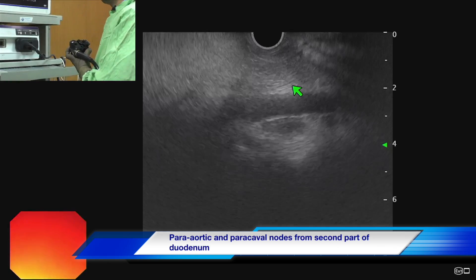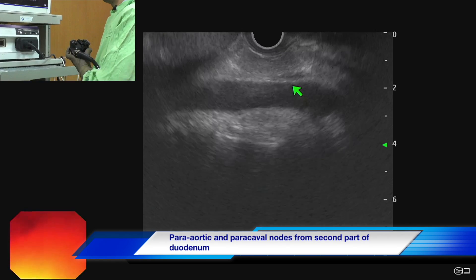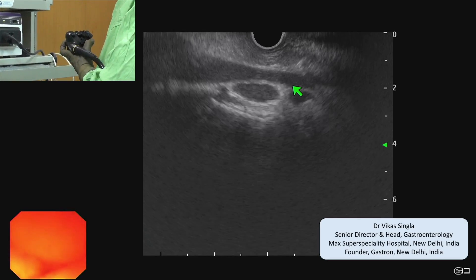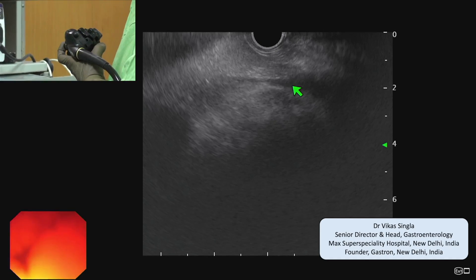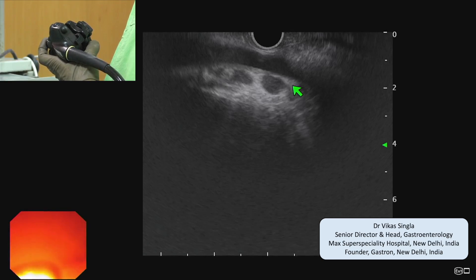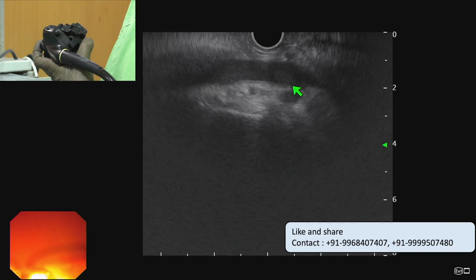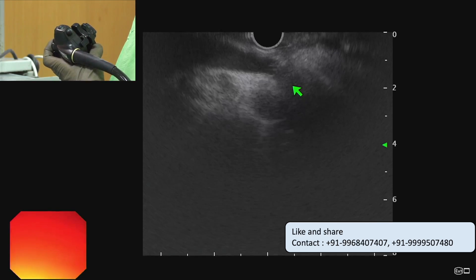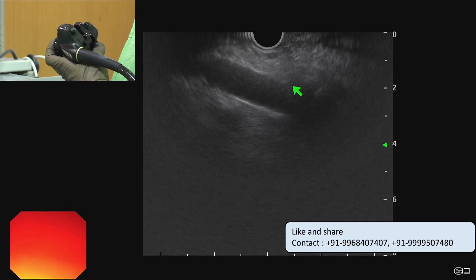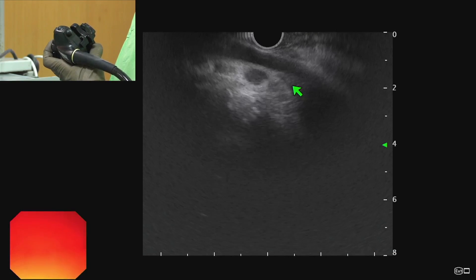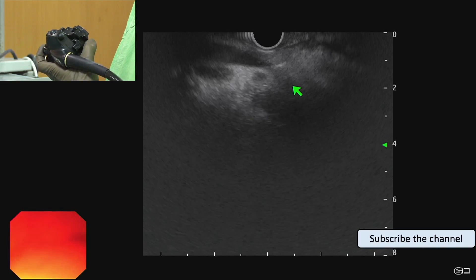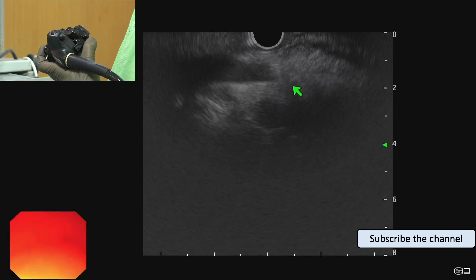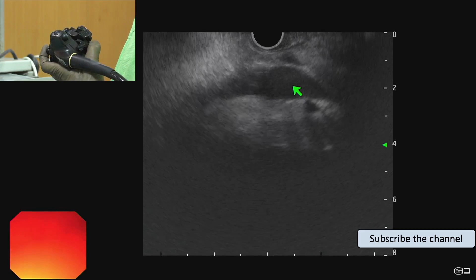Once we see the left kidney and rotate the scope clockwise, we can see a large linear vessel which is the inferior vena cava, and we can see lymph nodes in the paracaval region. Once we see the IVC and give a clockwise torque, we can see the aorta. We should be seeing the descending aorta, which is slightly away from the IVC.